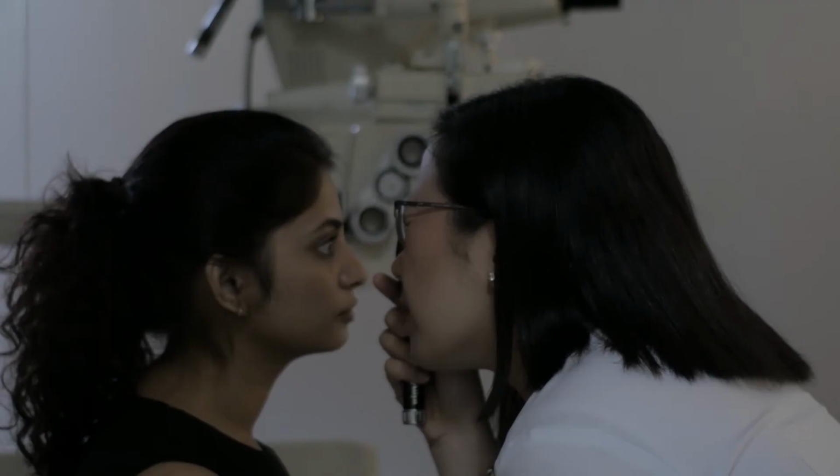Now we will perform direct ophthalmoscopy. The objective is to visualize the optic nerve head and the retinal structures in the posterior pole of the fundus. Note the peripheral fundus can only be visualized using an indirect ophthalmoscope. When performing direct ophthalmoscopy, remember, when inspecting the patient's right eye, you must use your right eye and your right hand, and vice versa.